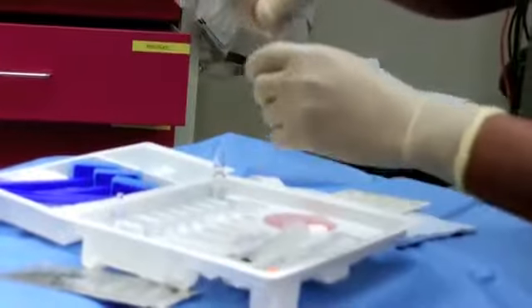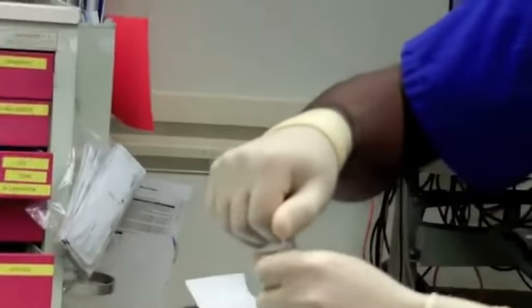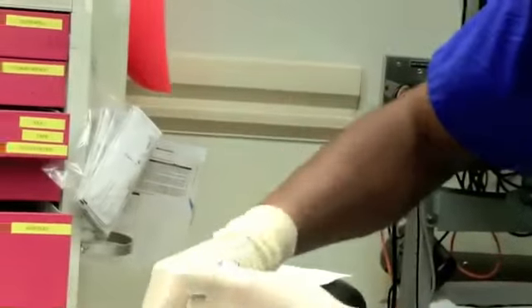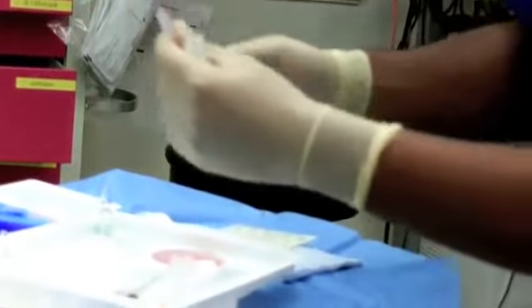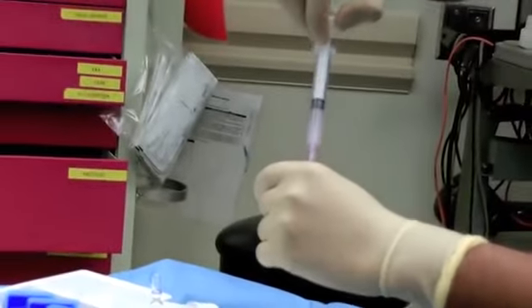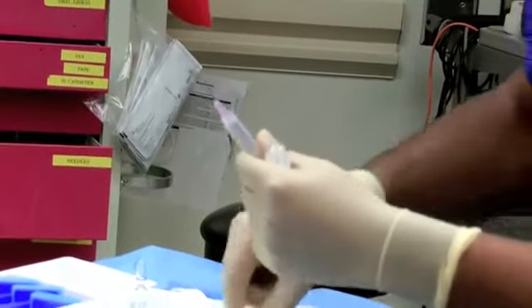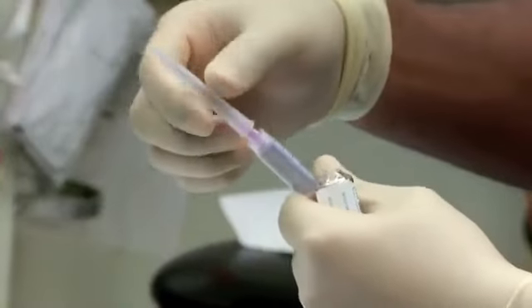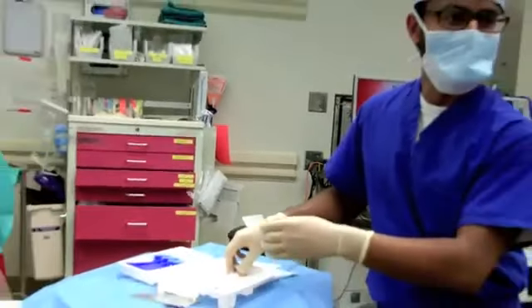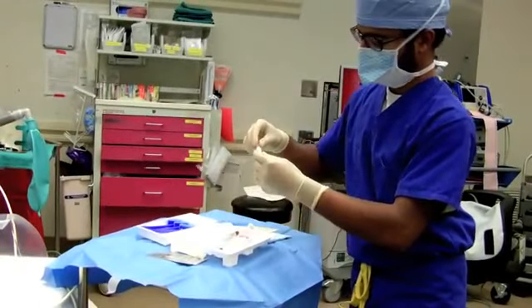So first, I'm going to draw my lidocaine in the 3 cc syringe. I'm going to switch the needles to the low gauge. In the 5 cc syringe, I'm going to draw bupivacaine.